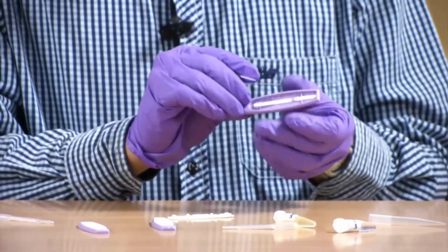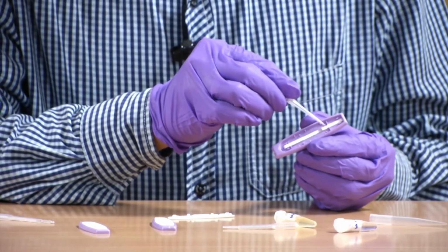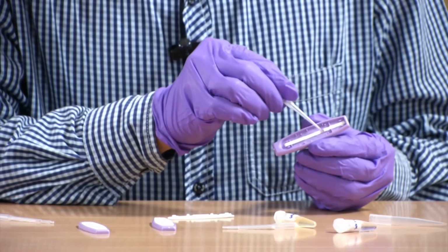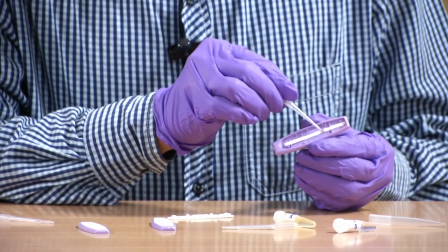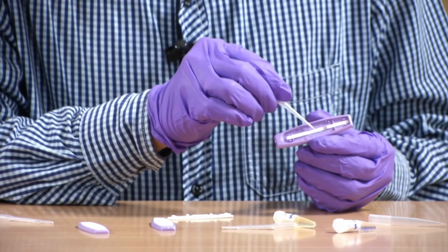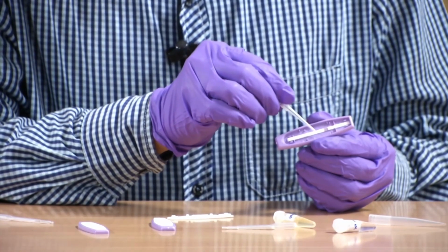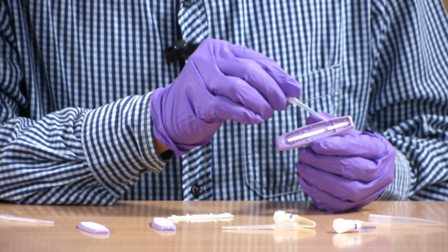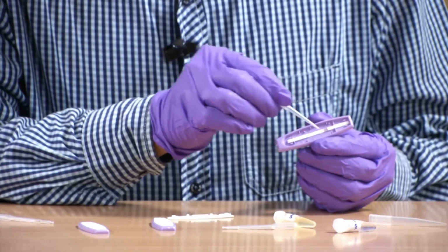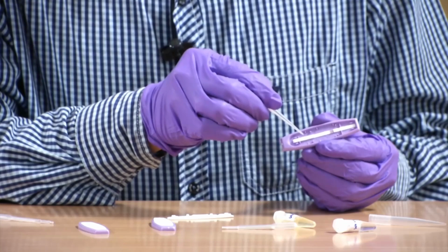As I told you earlier, this lateral flow assay contains various pads. The first one is your sample pad, where your sample will be loaded, and this colored one is your conjugate pad, where your antibody is conjugated with gold nanoparticles or some color beads. The one below is our membrane, the nitrocellulose membrane, where you have the test line as well as the control line. The test line contains antibody specific for your antigen, and the control line has antibody specific for the conjugated antibody, and this is your absorbent pad. This will absorb the excess sample.